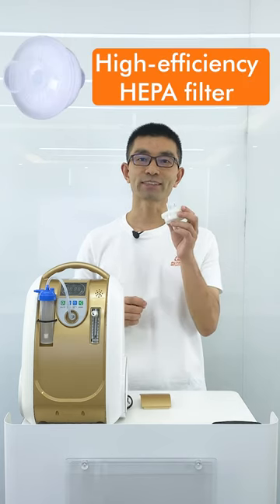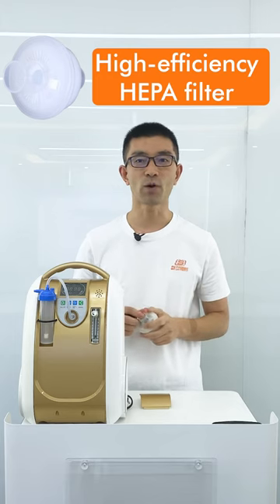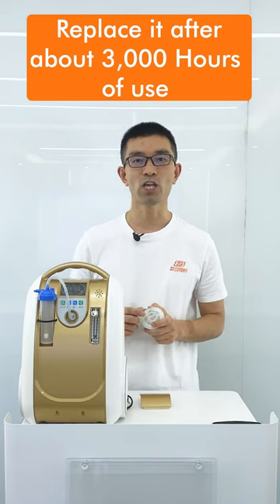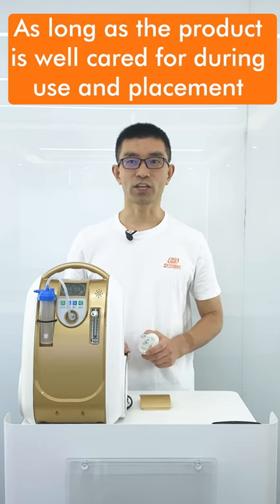This is the high-effective HEPA filter that can filter smaller dust that the first filter couldn't. It cannot be cleaned, so our recommendation is to completely replace it after about 3,000 hours of use.